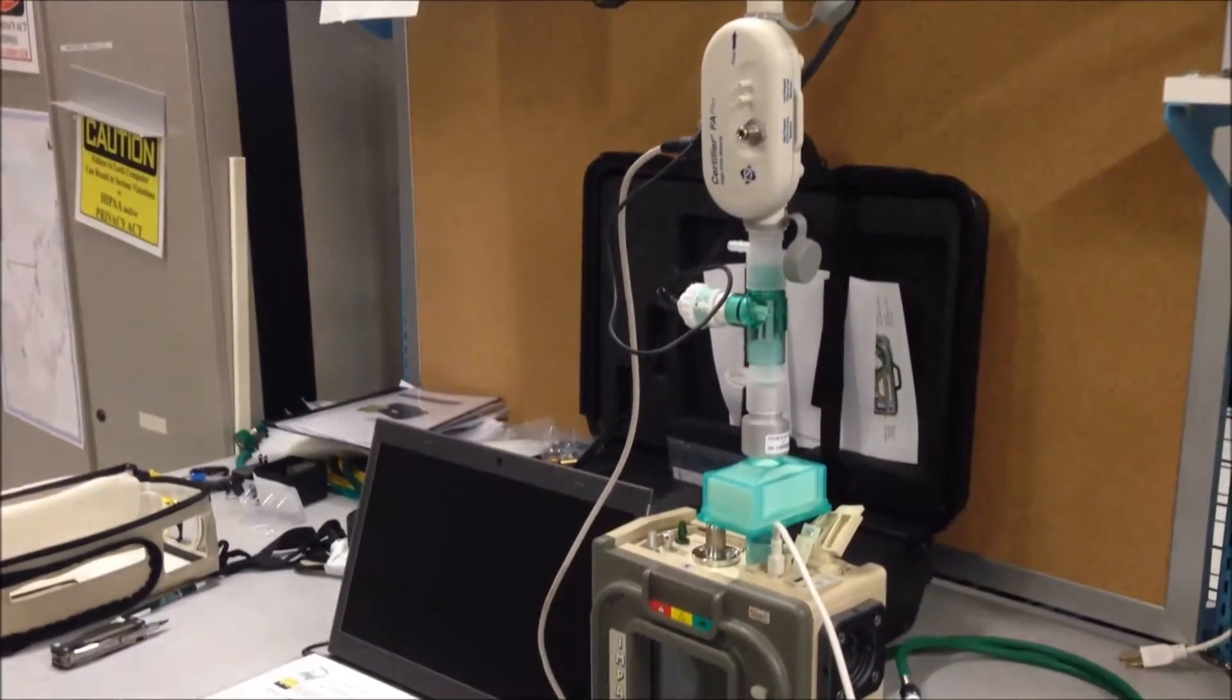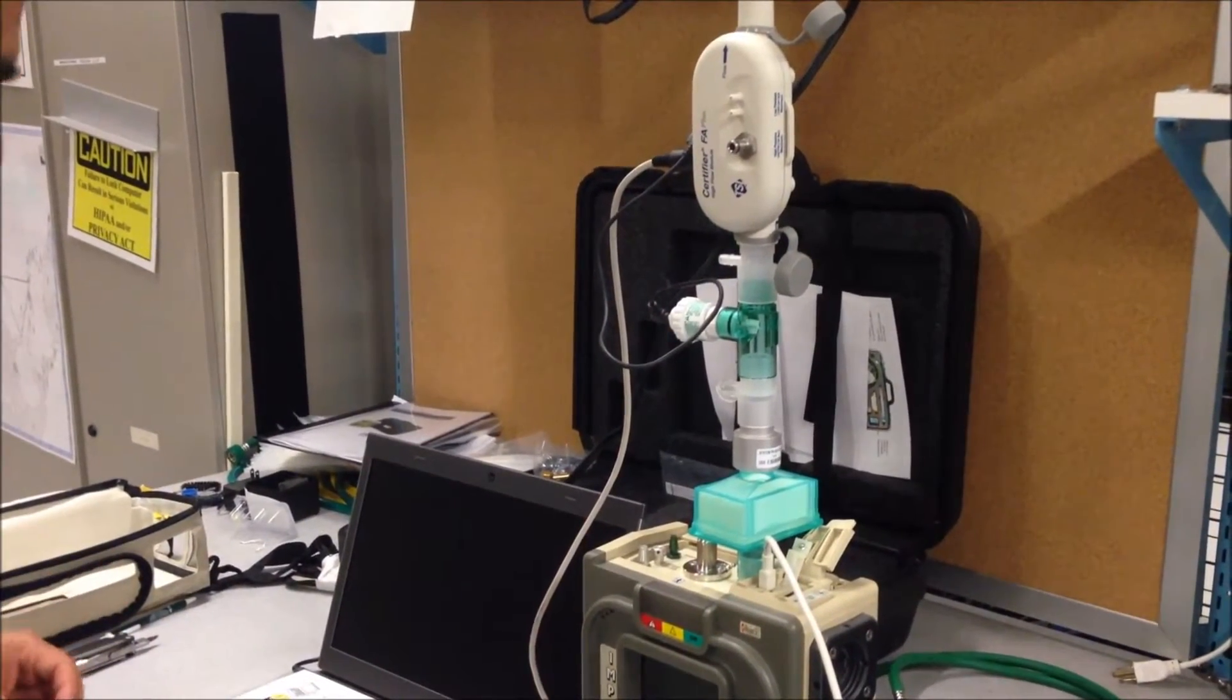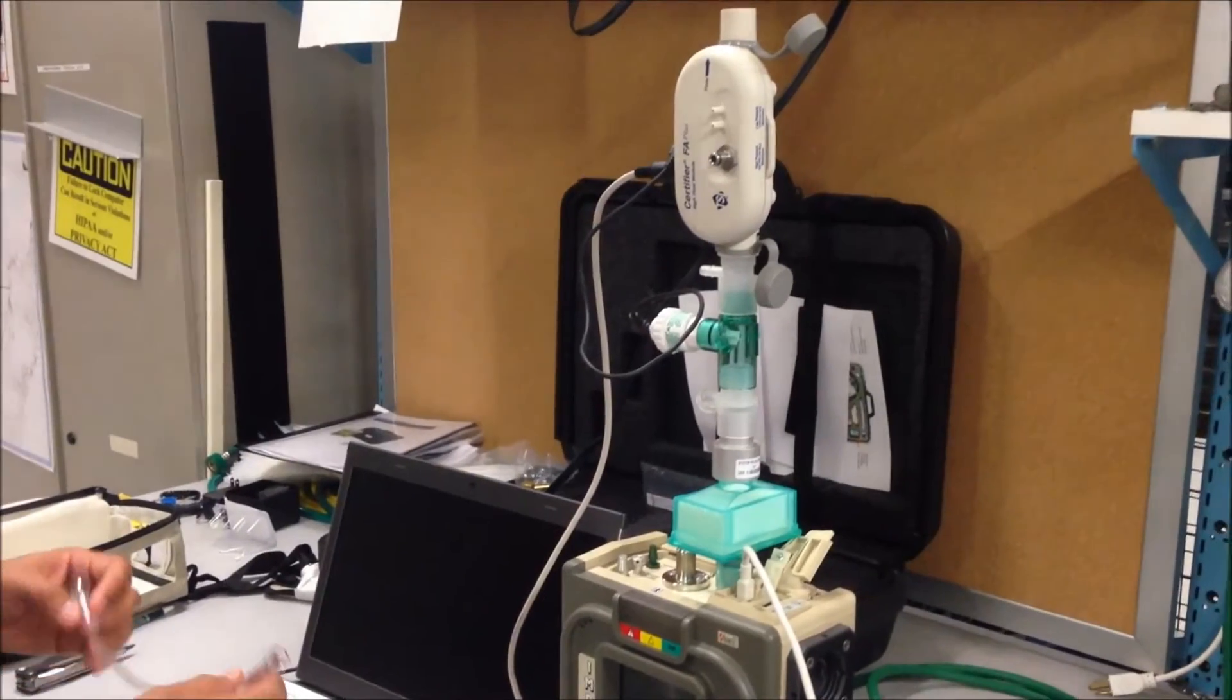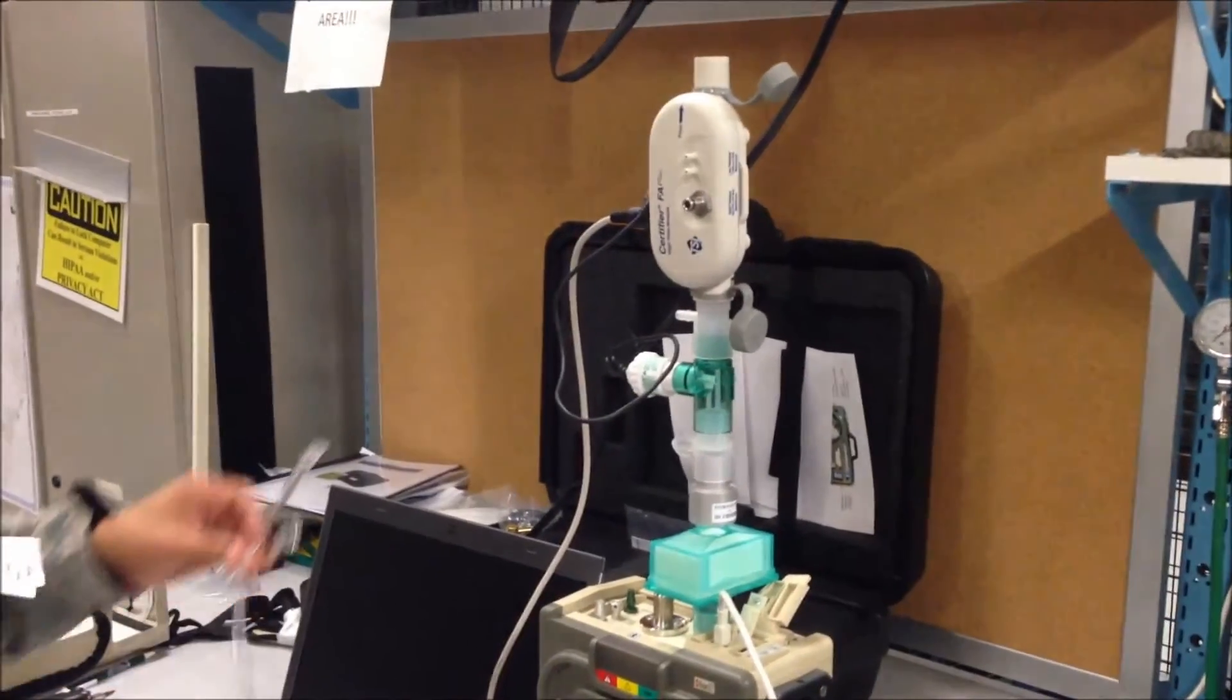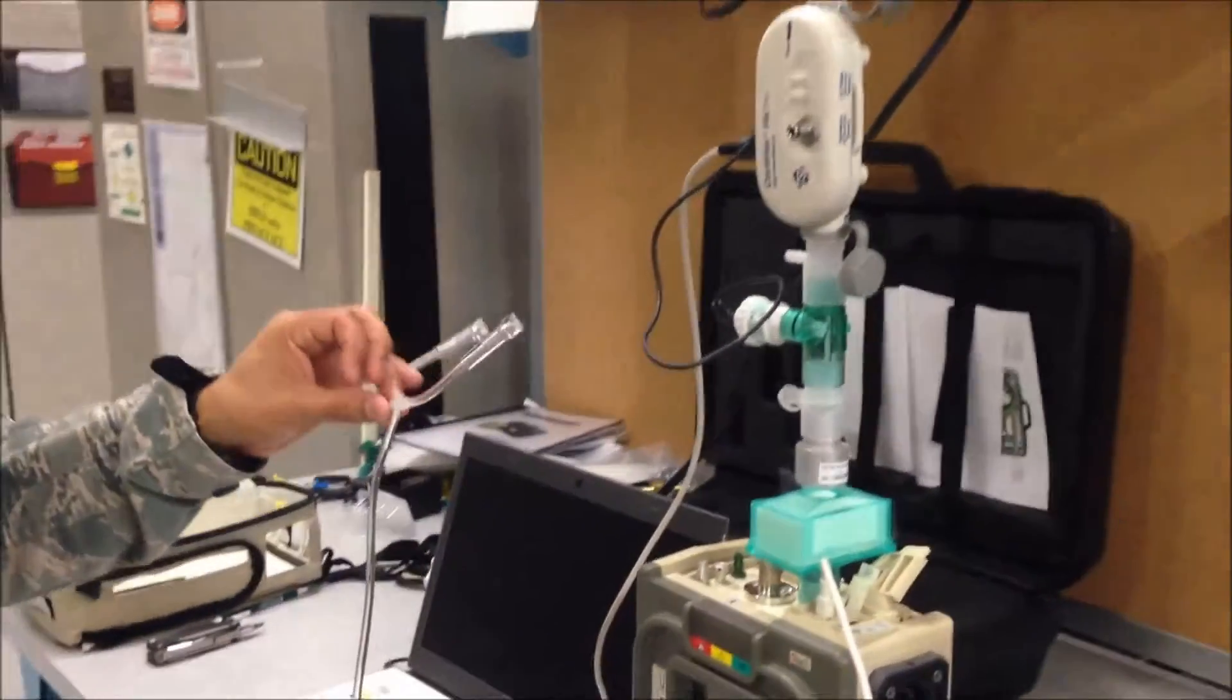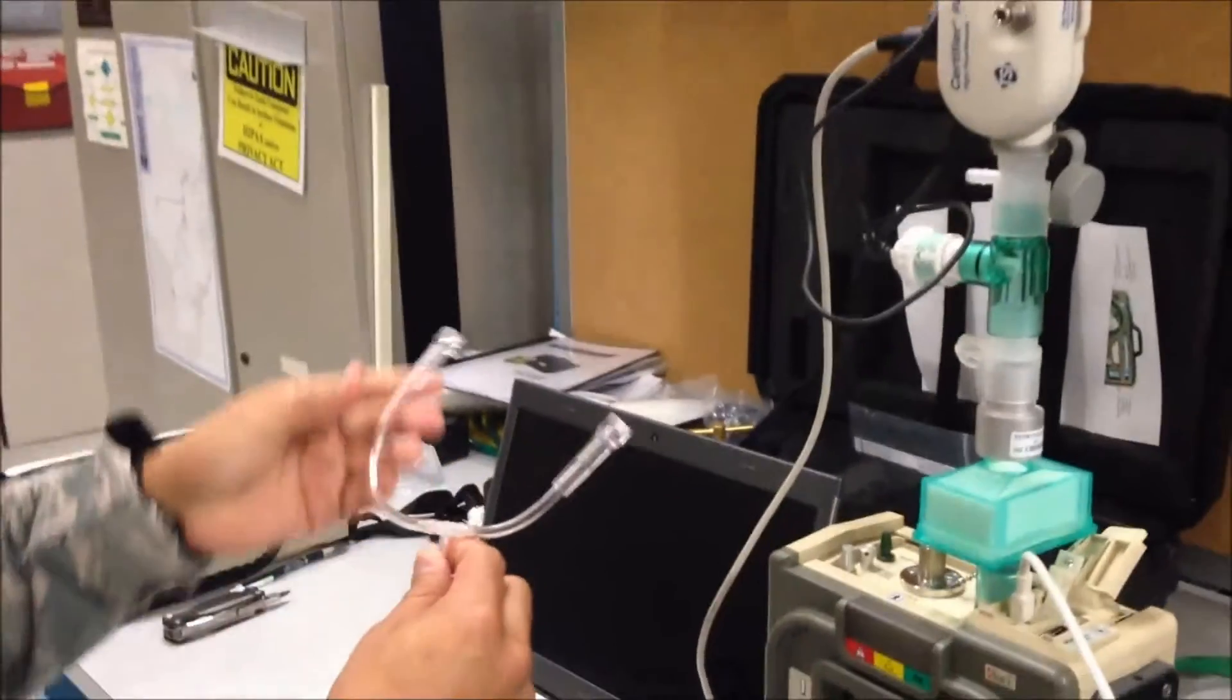Finish the calibration test setup by connecting an airway pressure transducer Y-tubing. This Y-tubing does not come in the kit, so you will have to make this yourself.